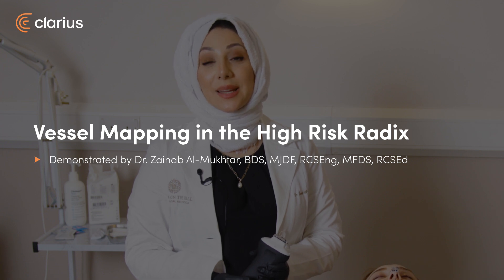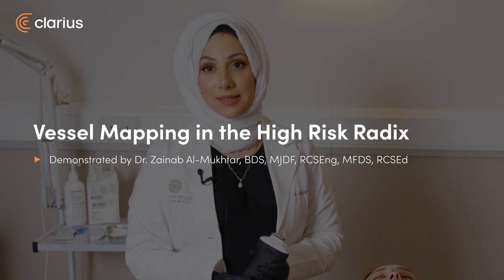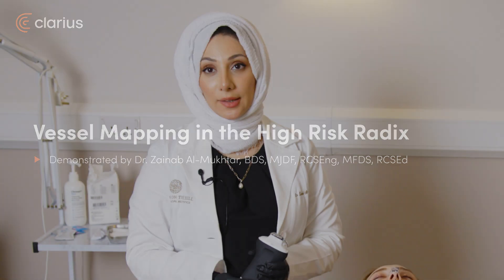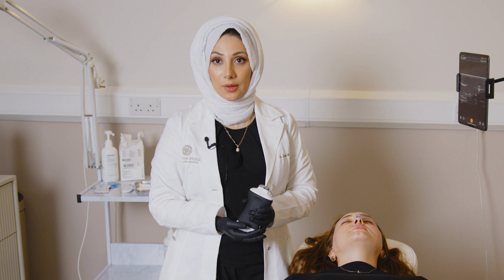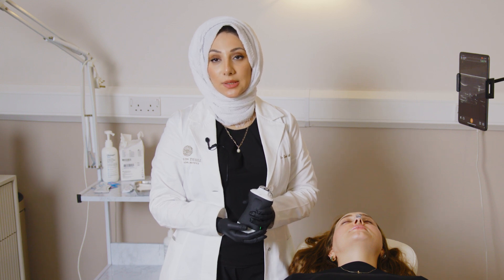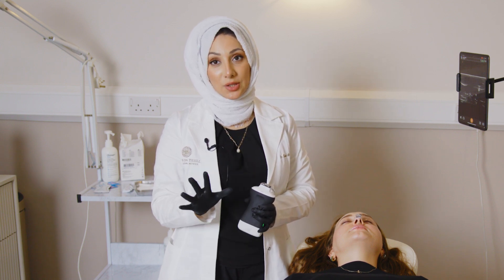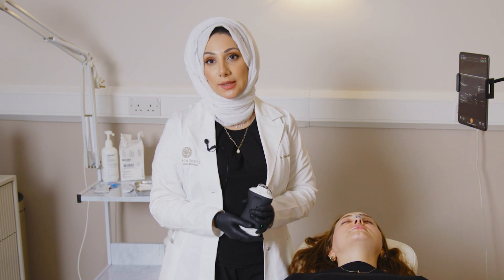My name is Dr. Zainab Al-Mukhtar. I'm an advanced aesthetic injector and an aesthetic injectables trainer, and today I'm going to be demonstrating non-surgical rhinoplasty with first the importance of scanning in order to map out the position of vessels before injecting.